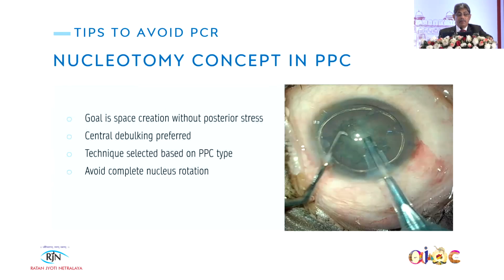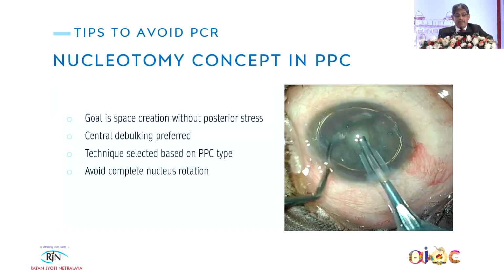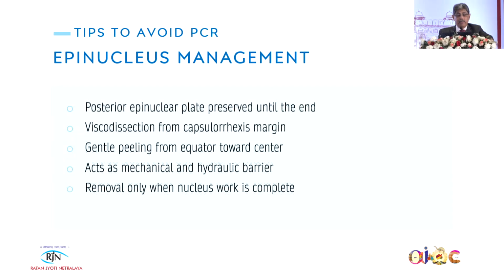Stability is very important. In nucleotomy, we should not rotate the nucleus fully, just disengage it from the epinucleus plate and leave it there as far as possible. Lambda and Y techniques are suggested, but what I do is remove the central nucleus first and then the epinucleus slowly. So the posterior epinuclear plate is preserved until the end.